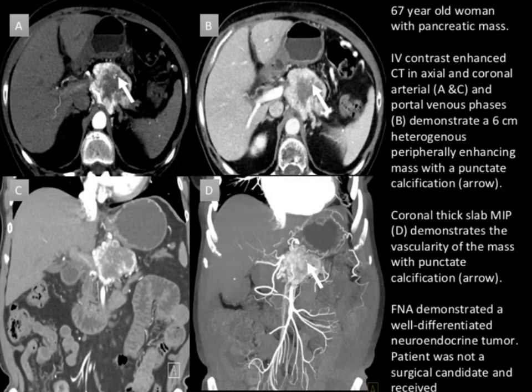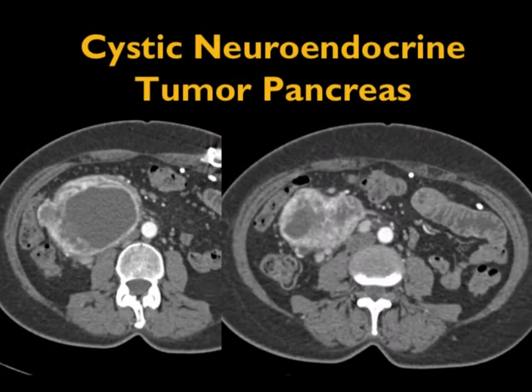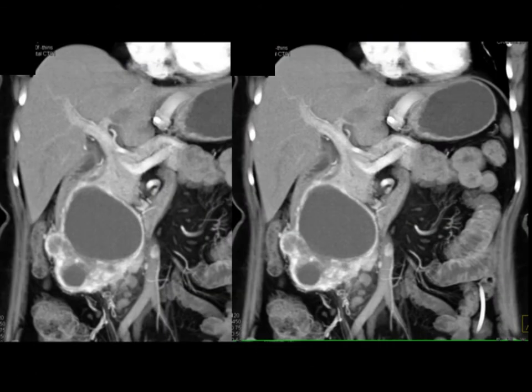Here are case examples showing calcifications in the head of the pancreas in one patient and in the tail in another — both had neuroendocrine tumors. Here's another example showing calcifications that can be very large or very small. And here's a lesion with minimal calcification — cystic and solid and hypervascular — that was a neuroendocrine tumor in the head of the pancreas.